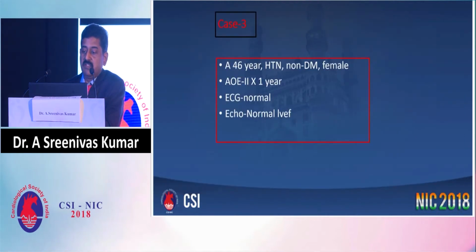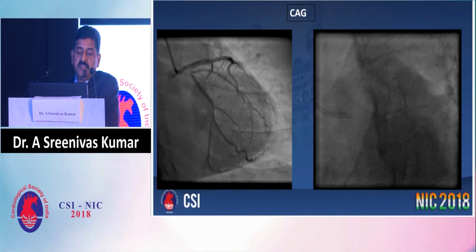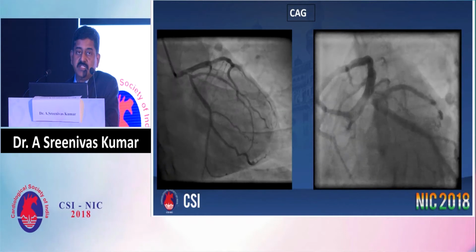Another case, I'll just close in another minute. A 46-year-old patient presented with angina on exertion. You see tight LCX disease. Many times we are always worried how to tackle such tight LCX disease.